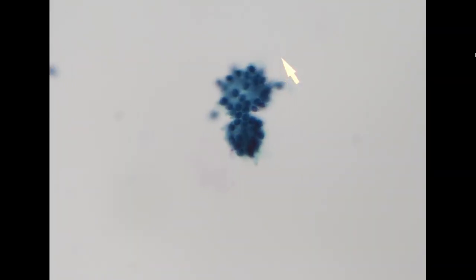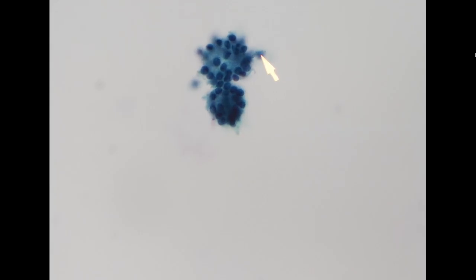The cells are mostly rounded with a uniform size. The chromatin pattern is condensed, not showing this ground glass pattern. The most striking feature is the arrangement. We do appreciate they are microfollicles, so it looks like aggregates of microfollicles. When we encounter this type of specimen, if the background shows no colloid and the majority of the specimen shows this microfollicular arrangement, we do not see any nuclear feature of PTC.